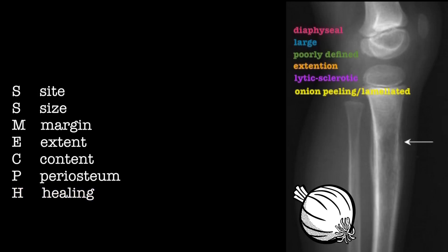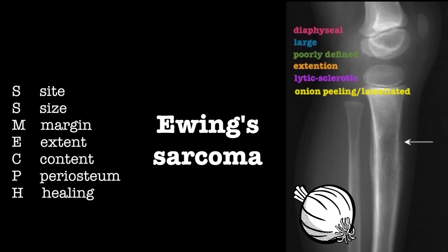So the lesion is a large, extensive diaphyseal lesion with poorly defined margins, onion peeling of the periosteum, and with a lytic and sclerotic appearance. This is typical of Ewing's sarcoma.